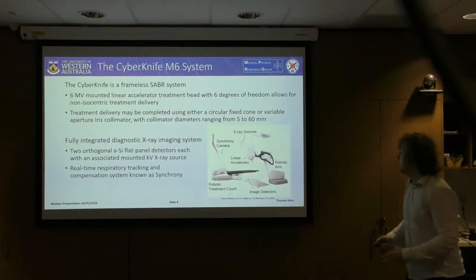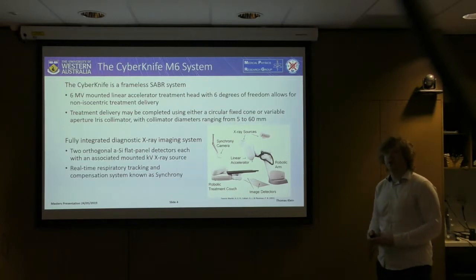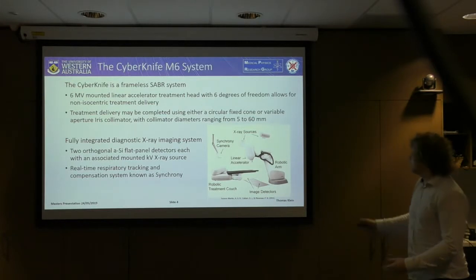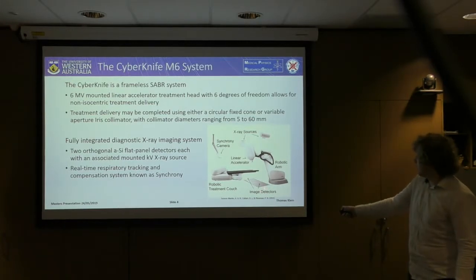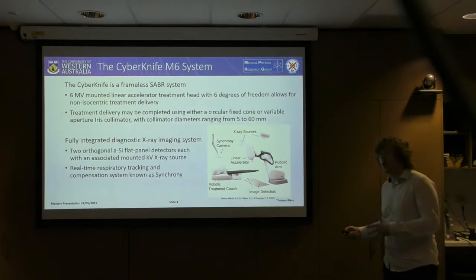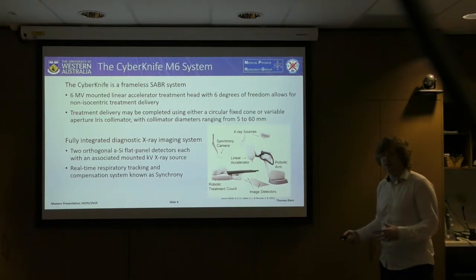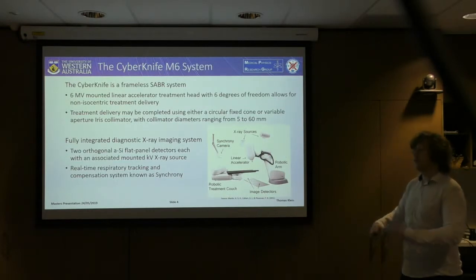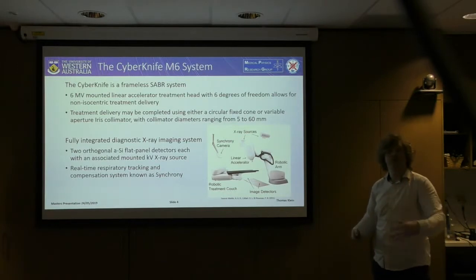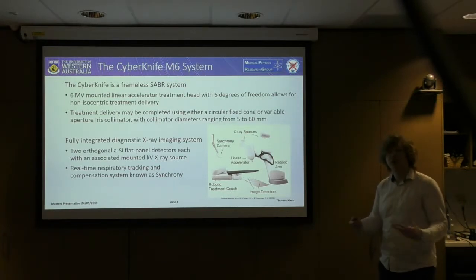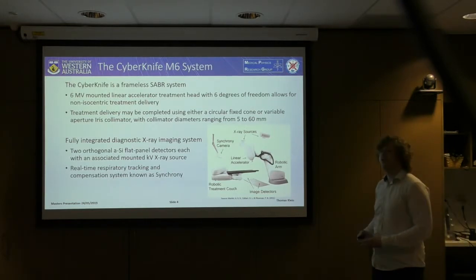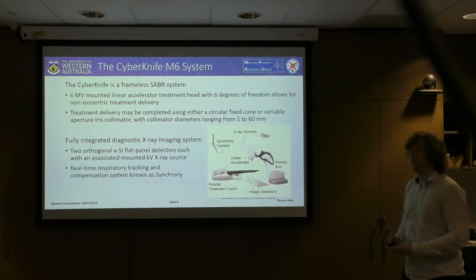You can see the collimator here. Perhaps the most important part of the CyberKnife system is that it's fully integrated with a diagnostic x-ray imaging system, consisting of two amorphous silicon flat panel detectors, each with an associated x-ray source capable of acquiring images during treatment delivery. These images feed back in a feedback loop to the linear accelerator head, allowing the robot's position to be adjusted during treatment delivery to follow the moving tumour in the lung, enabling real-time respiratory tracking and compensation — known as the Synchrony system.